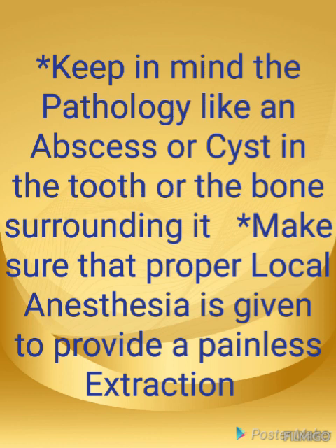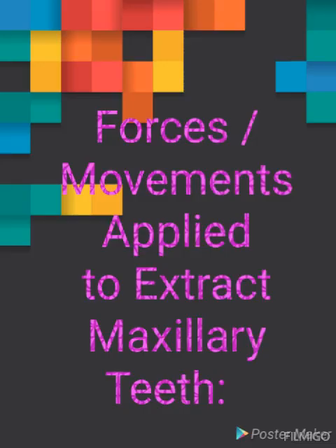Keep in mind pathology like an abscess or cyst in the tooth or the bone surrounding it. And it is very important to make sure that proper local anesthesia is given to provide a painless extraction. If we provide a painless extraction, then the patient will cooperate. First we are going to see the movements or forces applied to extract the maxillary teeth.